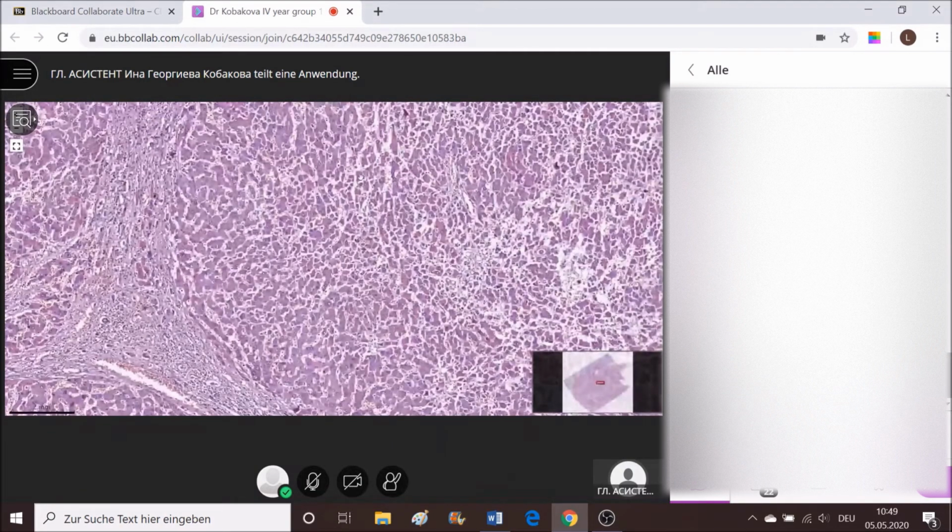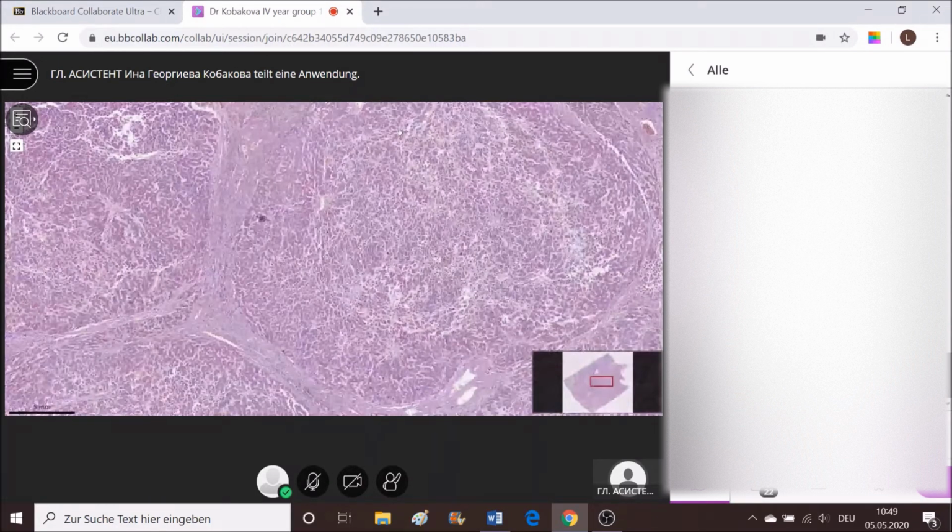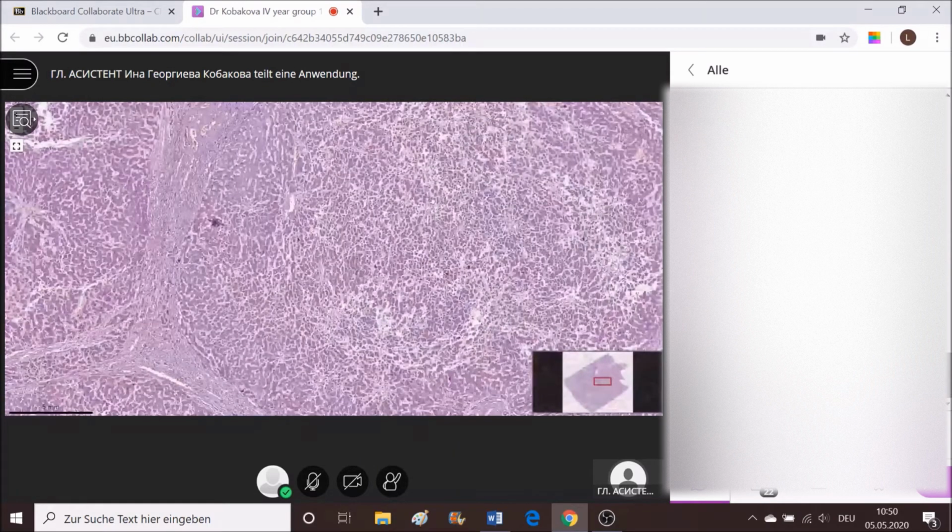Let's take a look at a smaller nodule. Well, there you go. 1, 2 combined together, 3, 4. No portal tracts at the periphery. A couple of central veins here and there. And no normal circulation of blood in the sinusoids. These are formed regenerative nodules after a process of necrosis eventually or fibrosis.